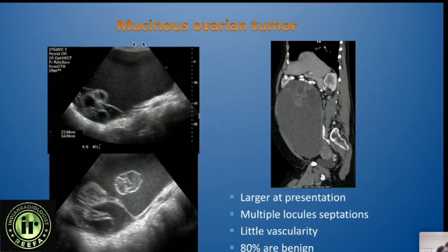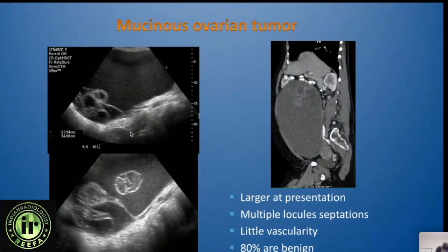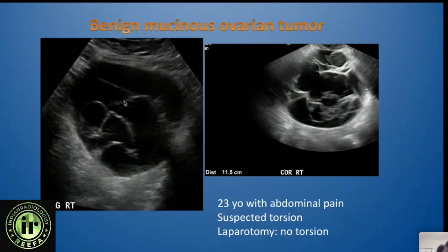Mucinous ovarian tumors tend to be very large at presentation — in this case, nearly 24 centimeters. They may have internal echoes, multiple locules and septations, and little vascularity. Although mucinous cystadenocarcinoma exists, the vast majority — about 80 percent — are benign. This next example shows a very complex appearance in a young patient where we suspected ovarian torsion, but at laparotomy she had a benign mucinous ovarian tumor.